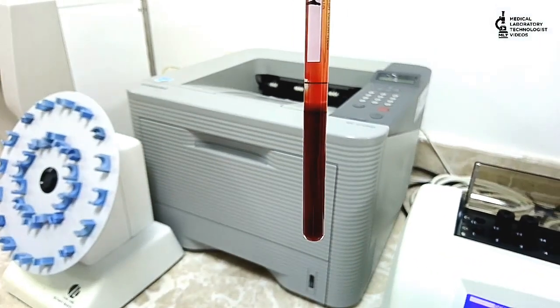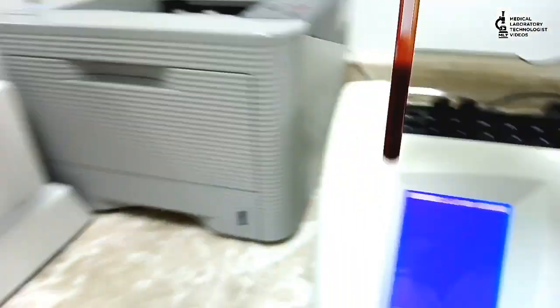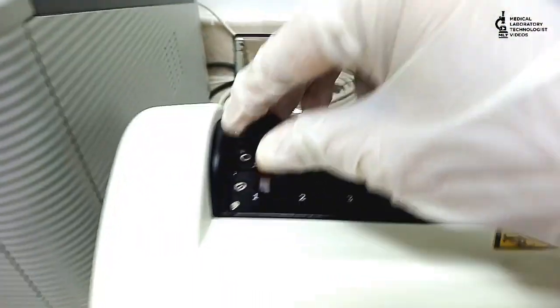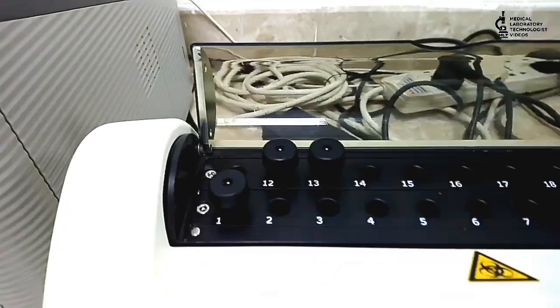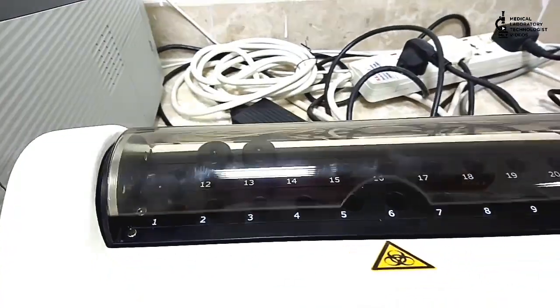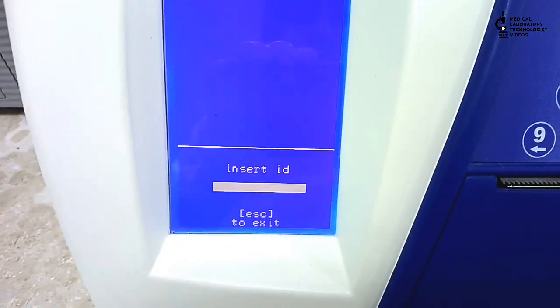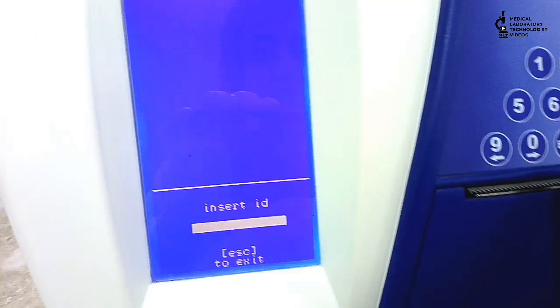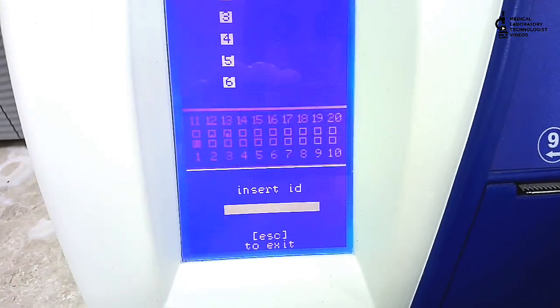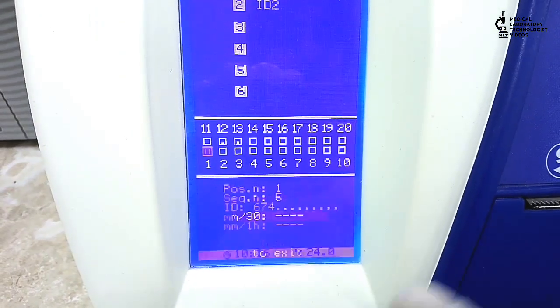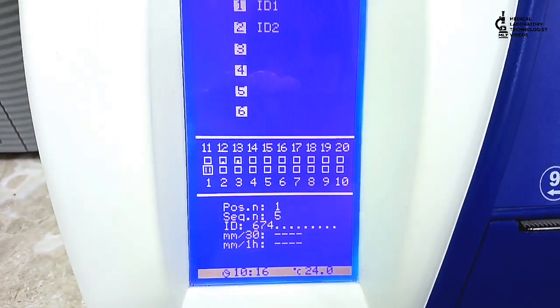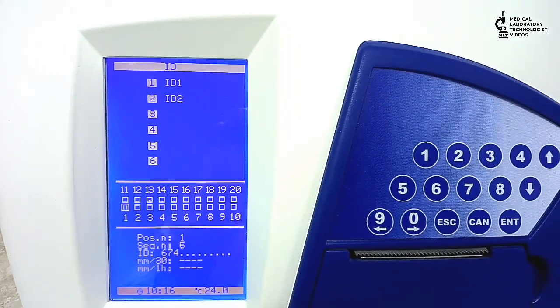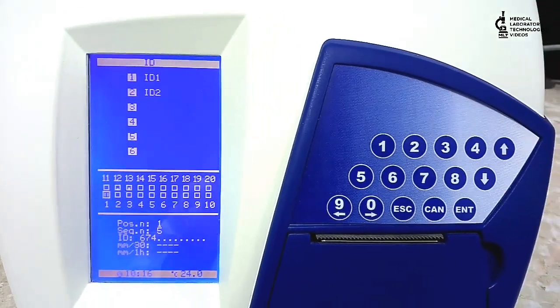Now I will keep it in any position, position 1 I keep. On the main screen we can see that position 1 is showing the sample ID. That sample is inside and we have to wait for 30 minutes.